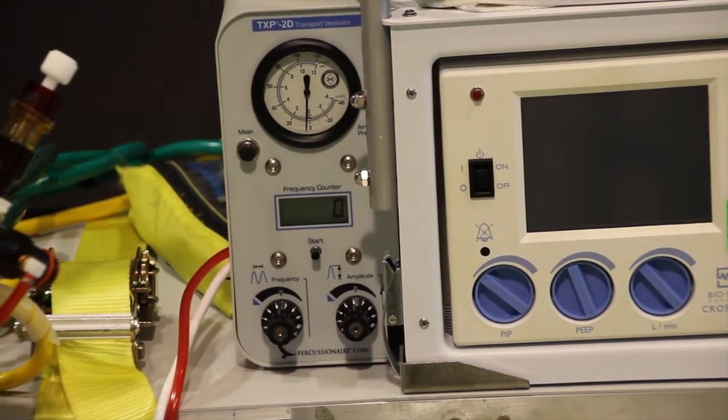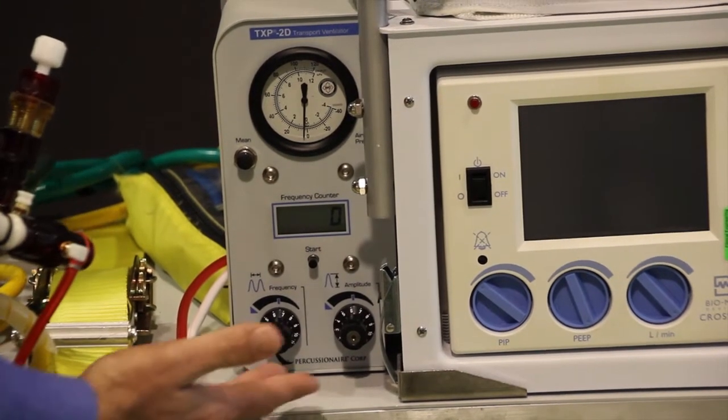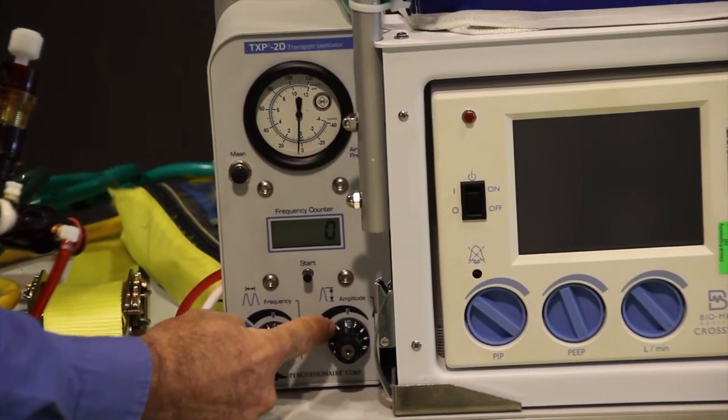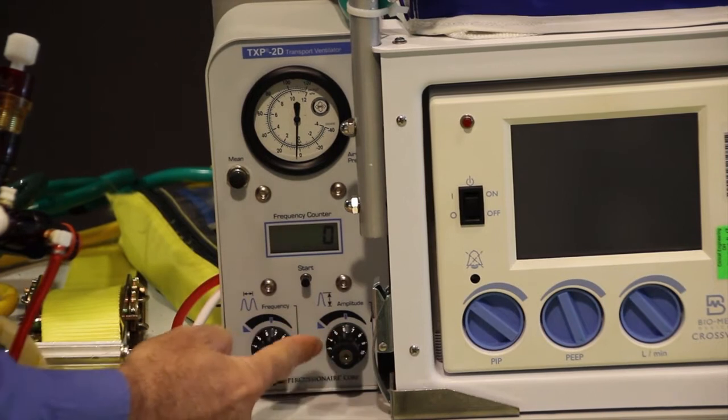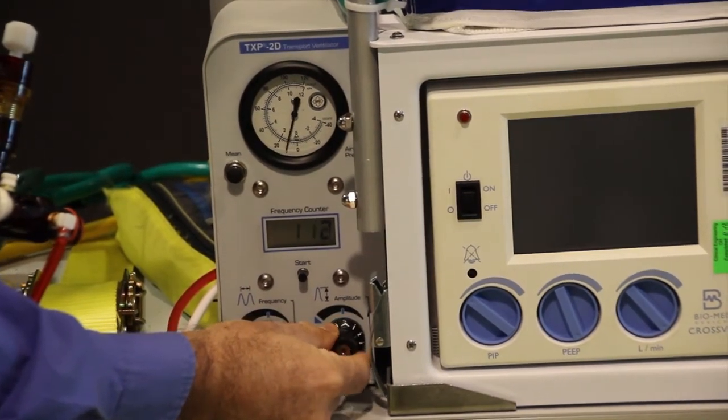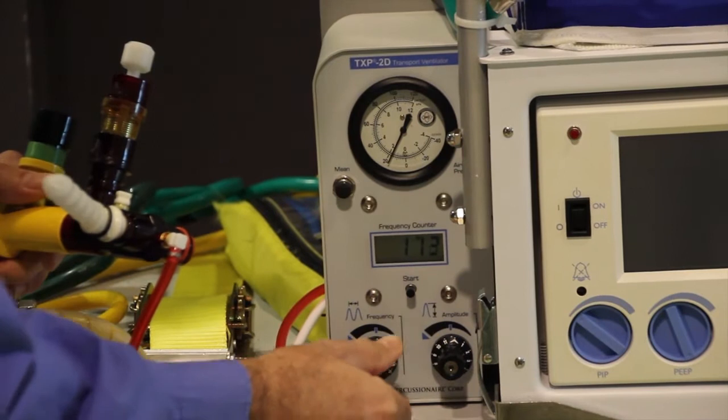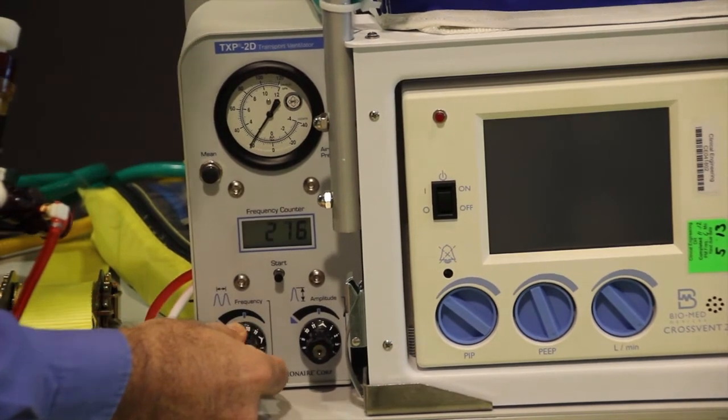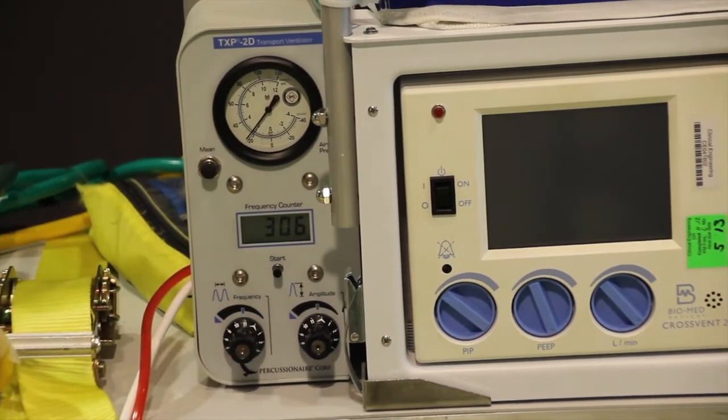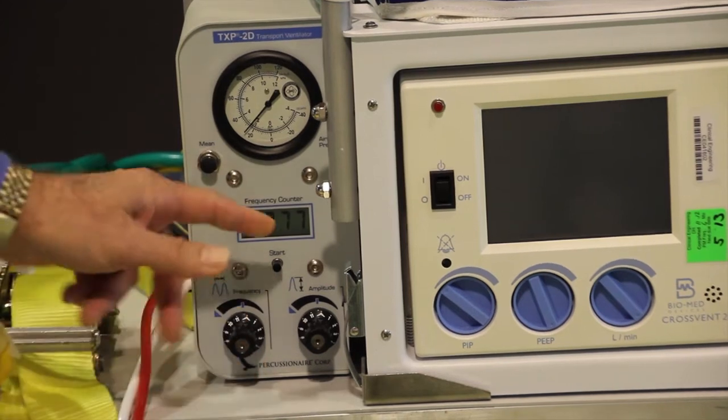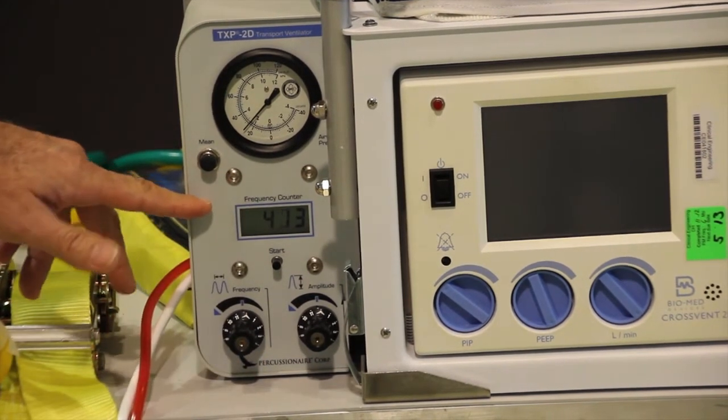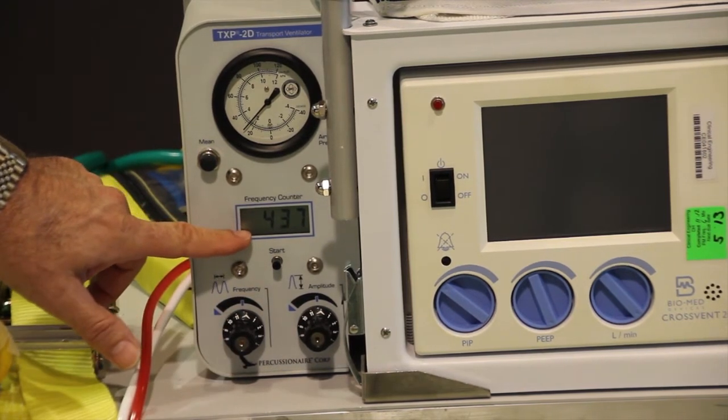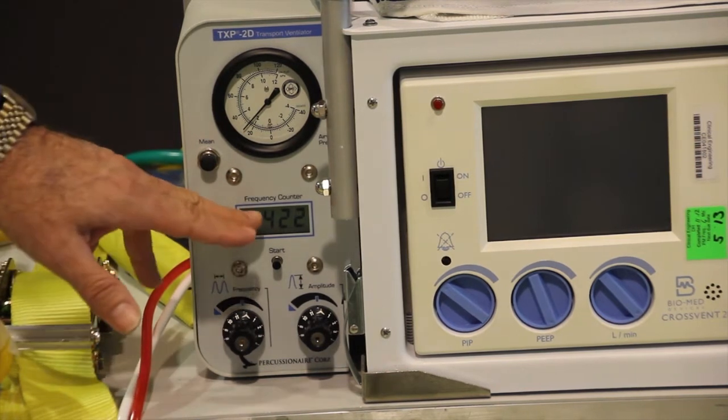We're going to convert the patient from the oscillator to the TXP. What we'll do is start off with the amplitude knob. As I said earlier, these numbers are just a reference point. I'm typically going to start this up around the 10 to 12 range just to give us some flow. Amplitude controls your tidal volume or your flow. I'll set the frequency, probably around 10 or 12, but ultimately I would adjust this down to about the 400 range. We're at about 420 right now, so I'm probably pretty good on my frequency.